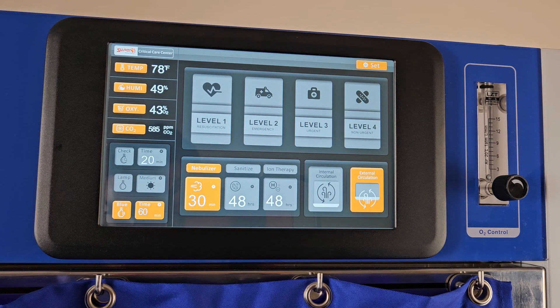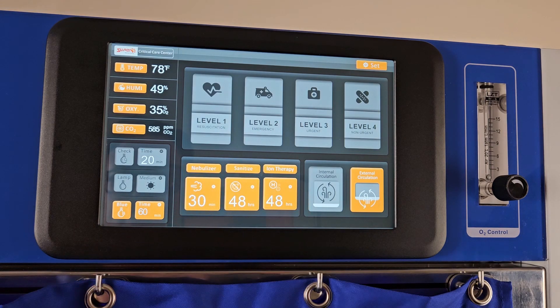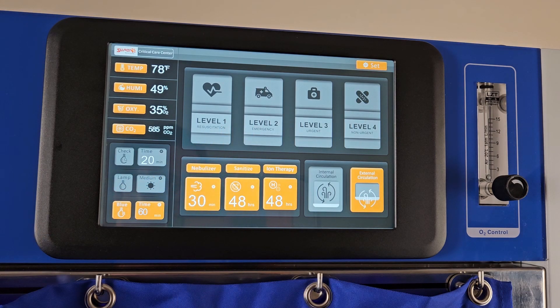You can turn on a sanitizing or ion therapy mode following the same method. Both the sanitization and ion therapy modes are safe to use with patients inside the cage and can be set between 12 and 96 hours. In the case of a power outage, the unit has a built-in battery that will provide up to 30 minutes of continued operation.